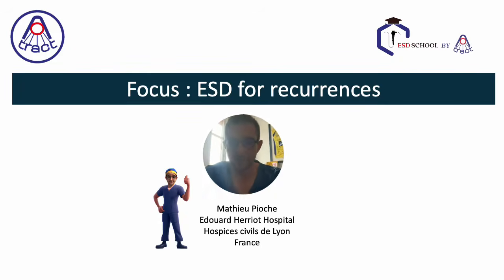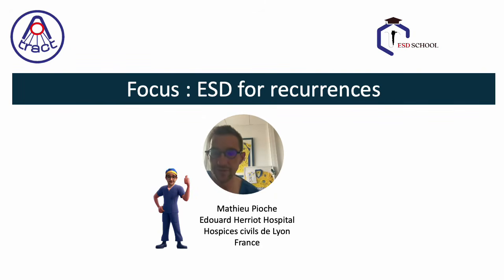Dear all, we are here for a new episode of the ESD school dedicated to the ESD for recurrences or for residual neoplasia after incomplete resection. So it's a focus dedicated to this.